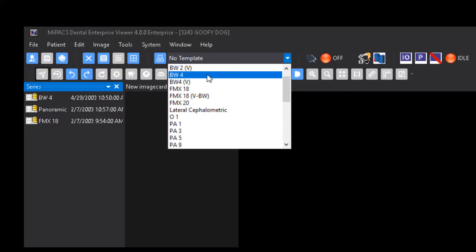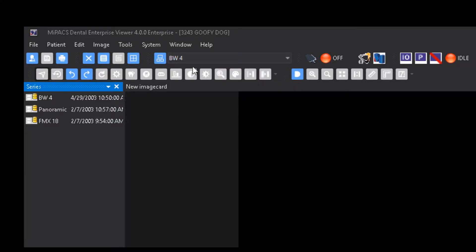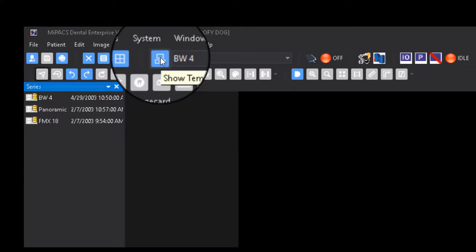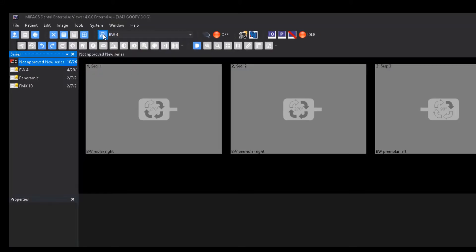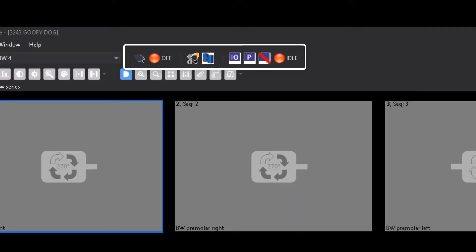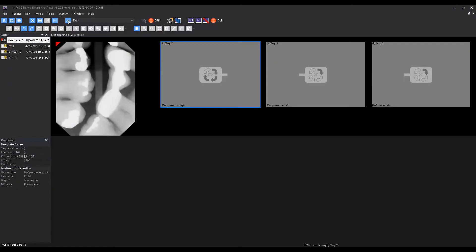Once the template appears on the screen, you may now activate the corresponding plug-in for the sensor you wish to take images with. The images will appear in the template frames in the order you capture them in.